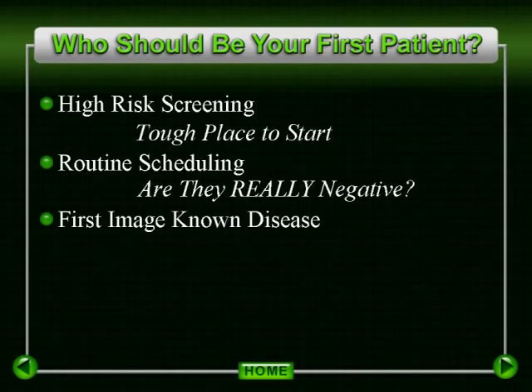The approach that we took as we first developed our breast MRI program was to begin imaging patients with known breast cancer diagnosed by standard imaging that had already elected to proceed to mastectomy. We found these patients by speaking with our breast surgeons and asking them for several referrals. We met with the patients ahead of time and explained to them that this exam would be performed free of charge, and also explained that this exam was unlikely to personally benefit them in the evaluation of their cancer. However, we did hope it would benefit future patients. We were amazed at the willingness of multiple patients who readily agreed to proceed.